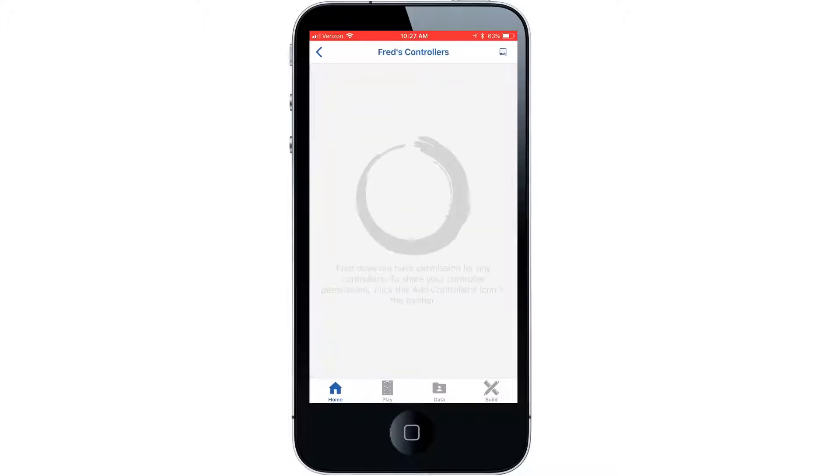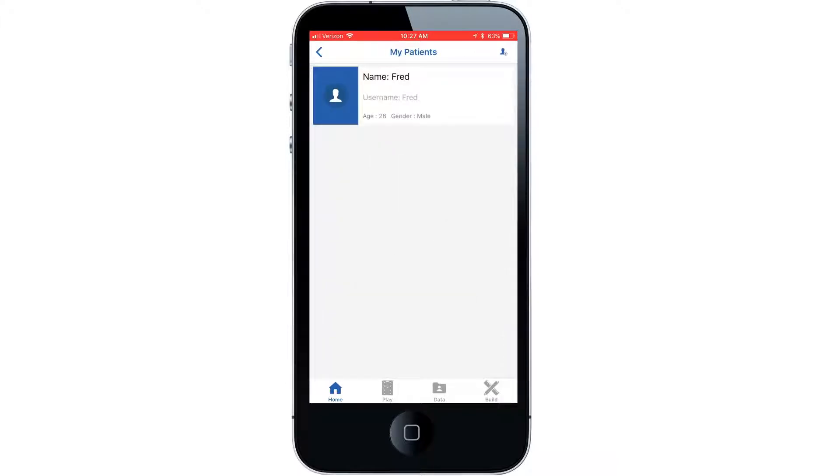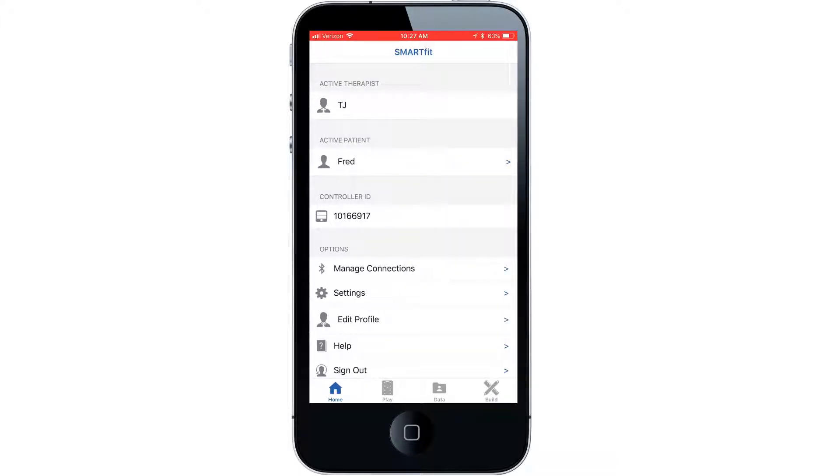Select the back arrow button, then the blue save button and it will take you to your list of patients. Select the patient you're working with so he or she shows up as an active patient.